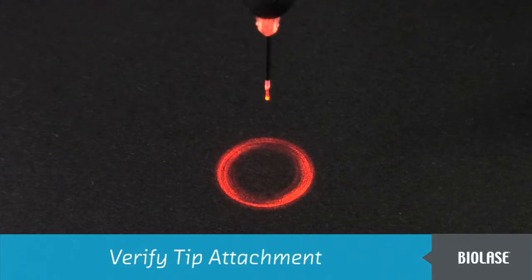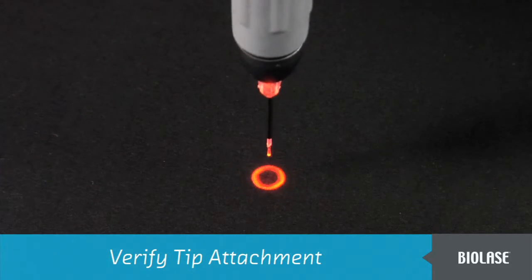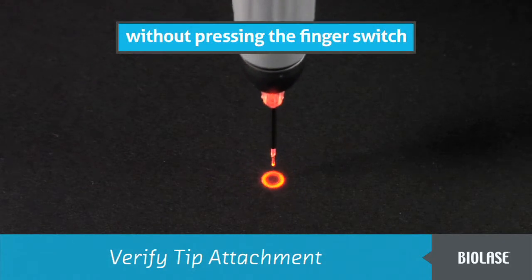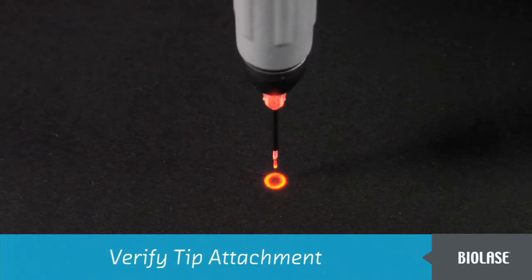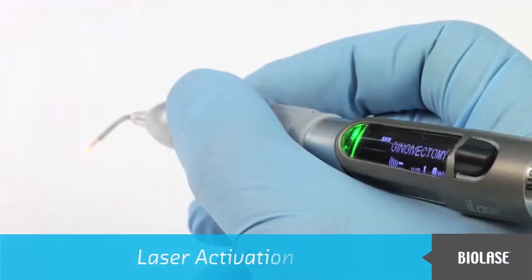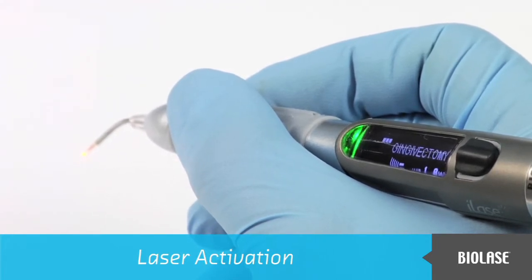To check if the tip is properly attached, shine the aiming beam from a straight tip, without pressing the finger switch, onto a surface such as a tabletop. If the red aiming beam makes a pattern of a circle, the tip is connected properly. The laser can be activated only when the iLase is in ready mode, which is noted by a green LED and the appearance of the red aiming beam.